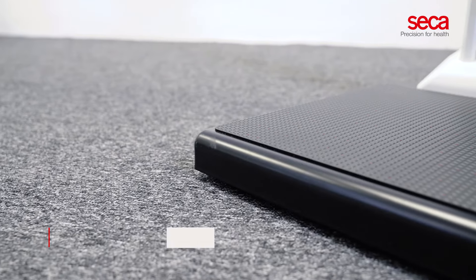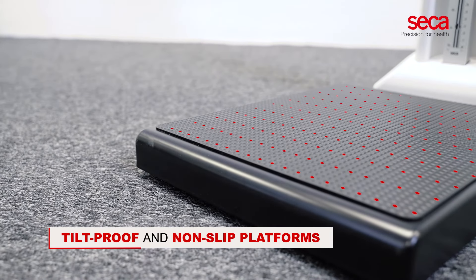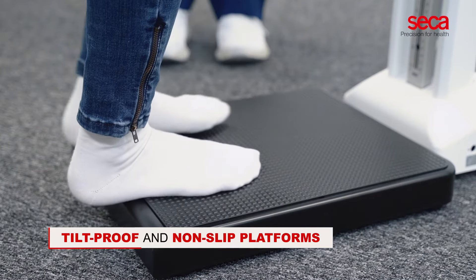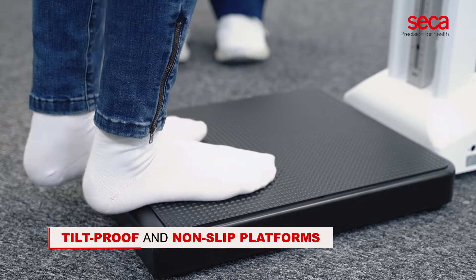The tilt-proof and non-slip platforms ensure stability and safety of your patients. The scales do not tip over, even when your patients accidentally step on the edge of the platforms.